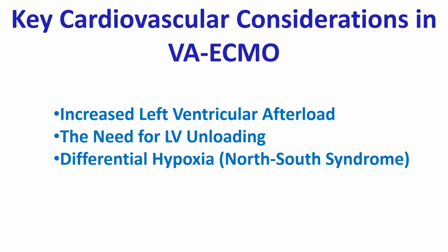The need for LV unloading. Because of increased afterload, VA ECMO is frequently paired with an LV unloading strategy. A concurrent intra-aortic balloon pump, or Impella, often termed ECMella or ECPella, or surgical vents is crucial to unload the left ventricle.